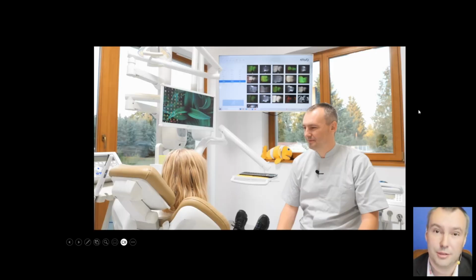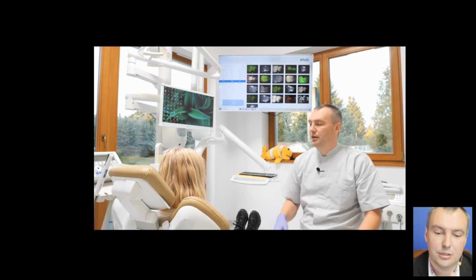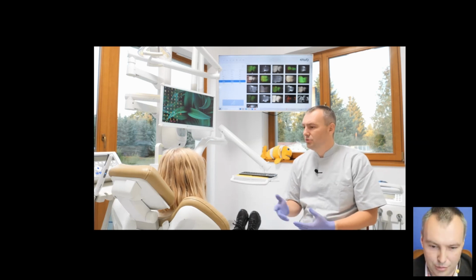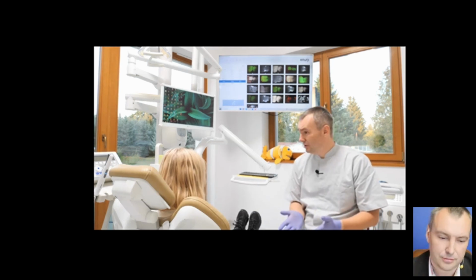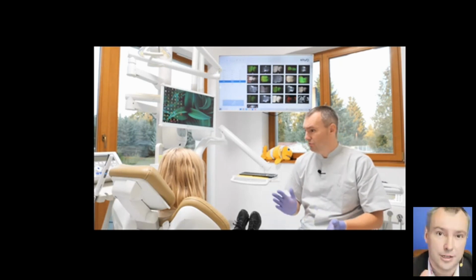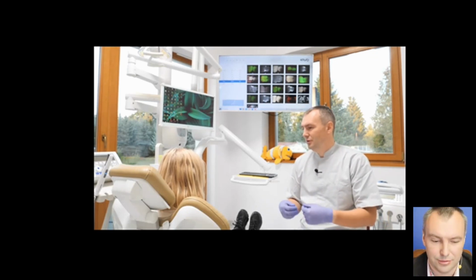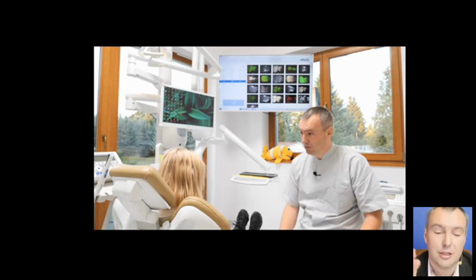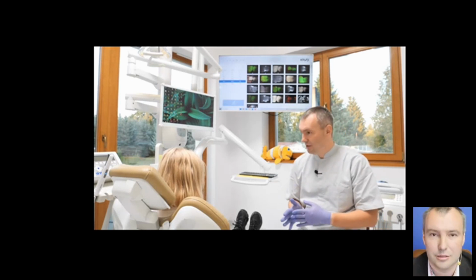So this is how the patient is seated, and this is how I start the diagnostic examination with the patient. I say that today it will be just an examination visit. It will be completely painless and not problematic. I always start with 3 questions. One is, do you feel any pain with the teeth? Do you see any bleeding from the gingiva? Usually the patient nods no. And third question, do you have any problem with food particles stacking between the teeth? Very often the patient nods. This is how we start to look for problems in the interproximal region.